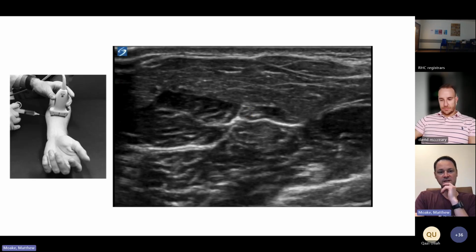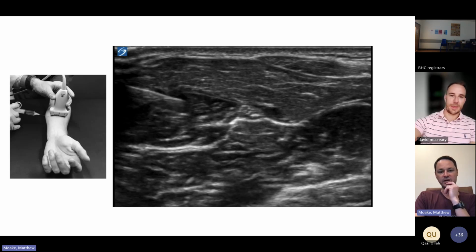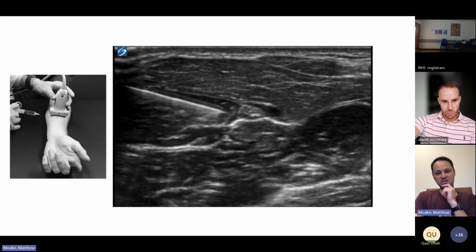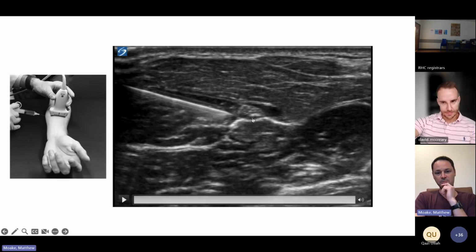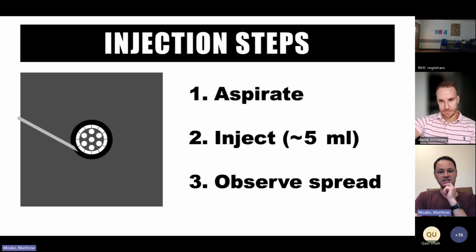Needle's going to be coming in from screen left. Goal with this is always knowing where your needle tip is, right? Any ultrasound guided procedure, you really should not be advancing the needle unless you can see the tip well. And we're walking it to the nerve. And again, most of the time I'd try to march it just past, inject, and then let myself flow in through here. Once you've got the needle there, deposit your anesthetic.